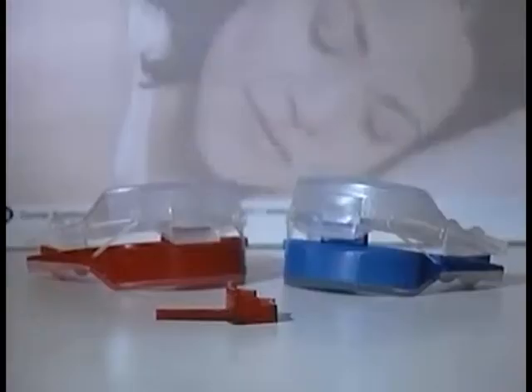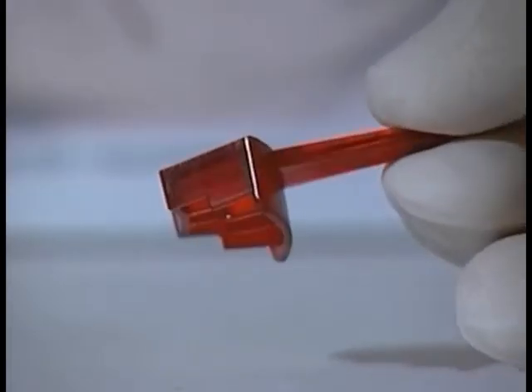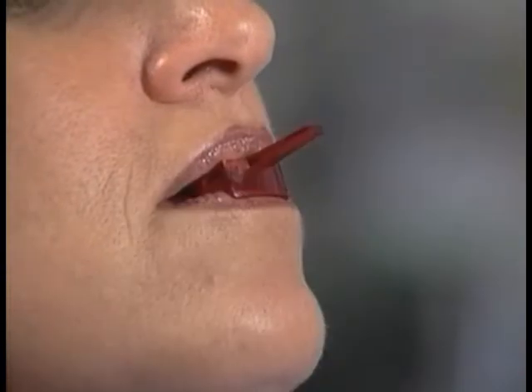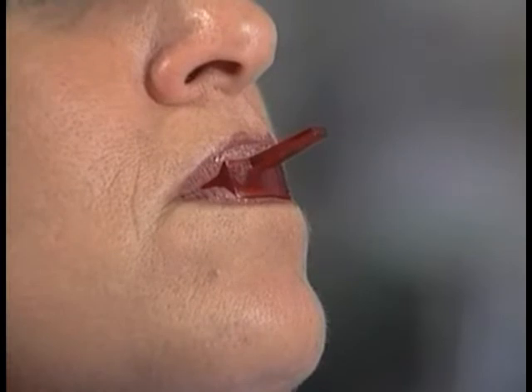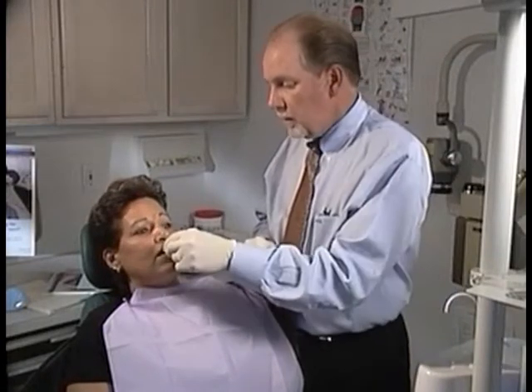The NORAD anti-snoring device is available in two openings: 5mm and 7mm. The enclosed bite guide will help you determine which size NORAD to use. Have the patient bite on the first step — 5mm opening — and then on the second step — 7mm opening — breathing normally each time. Have them advance the mandible to a near edge-to-edge position. The step that results in the best breathing indicates which appliance to use. If both sizes feel the same, start with a 5mm.